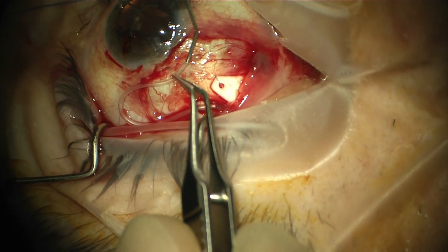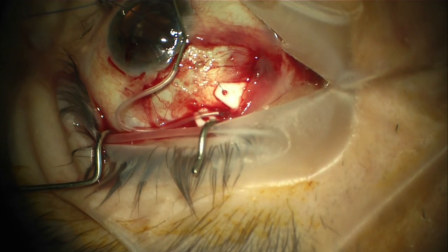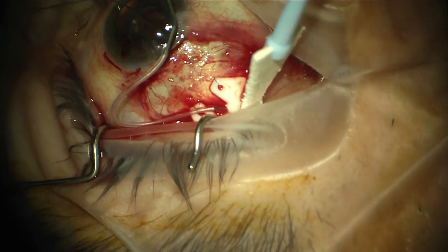The packaged ripcord suture could also be used here if desired. Once the ligature is in place, we are cannulating the tube and flushing it with BSS, just ensuring there is no flow.